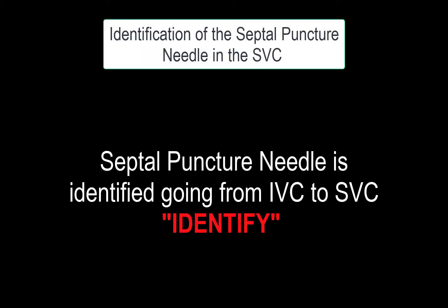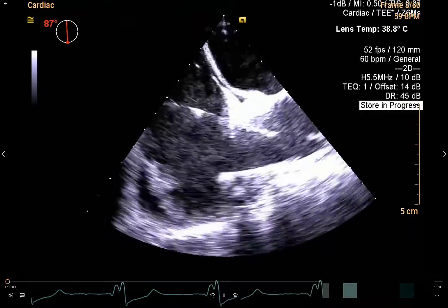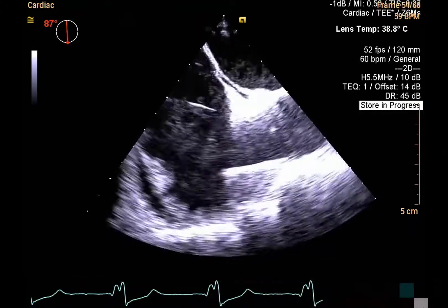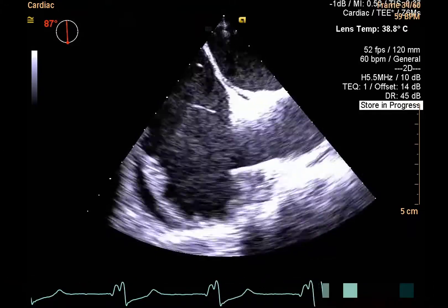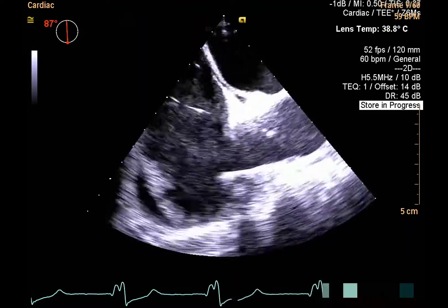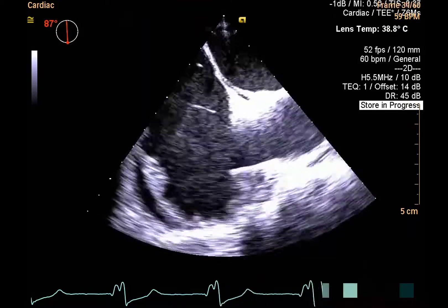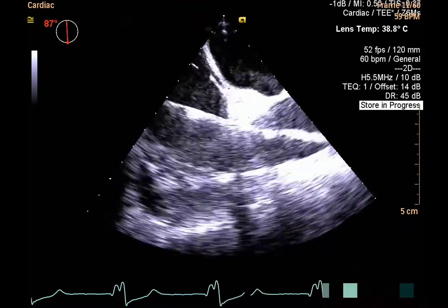During the identification process, the septal puncture needle is identified echocardiographically in continuity from IVC to the SVC. The mid-esophageal bicaval window is acquired to positively identify the septal puncture needle going from the IVC to the SVC. The key point is to locate the entire length and particularly the tip of the needle for optimal tracking.